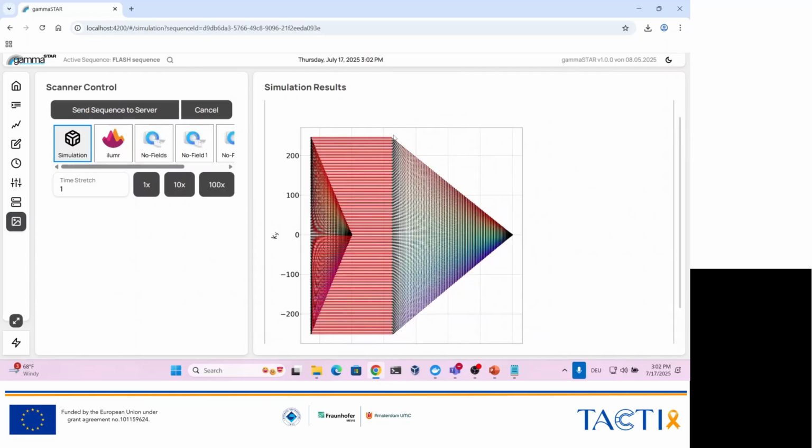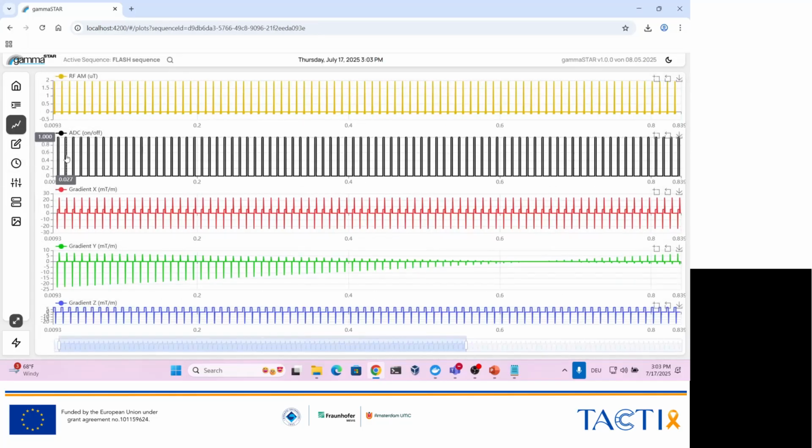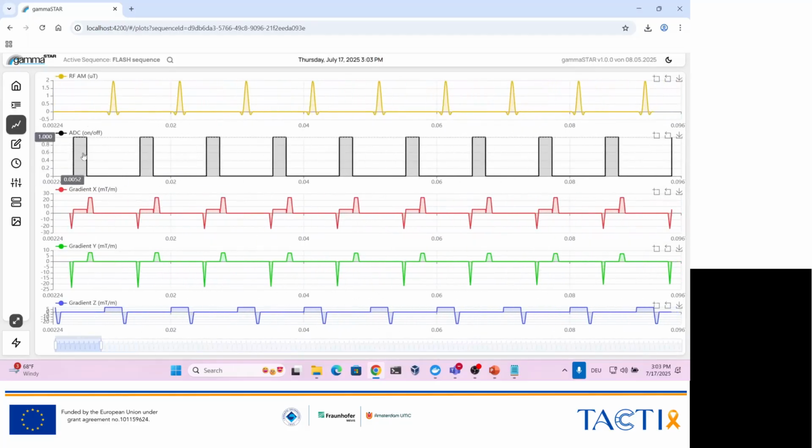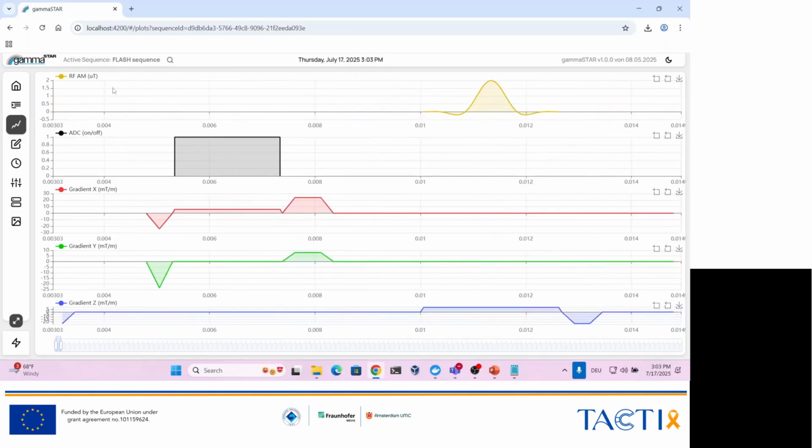this red area here is actually our K-space area that we want to acquire. Everything else is just helping us to get there. So what's happening is, and we can look at the sequence diagram, we excite our two-dimensional slice, and then our spins are excited, and we think about what we need to do to get our K-space data.